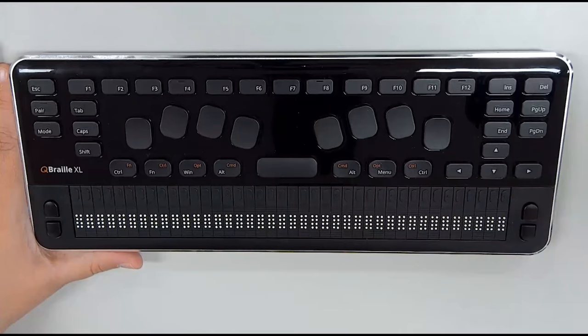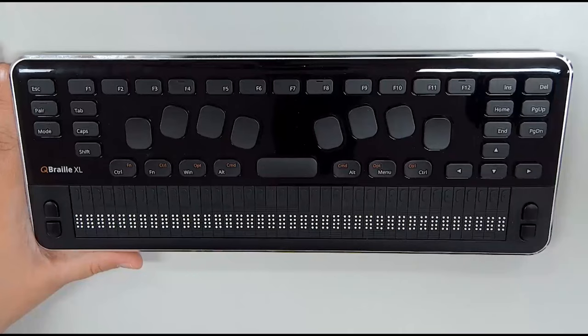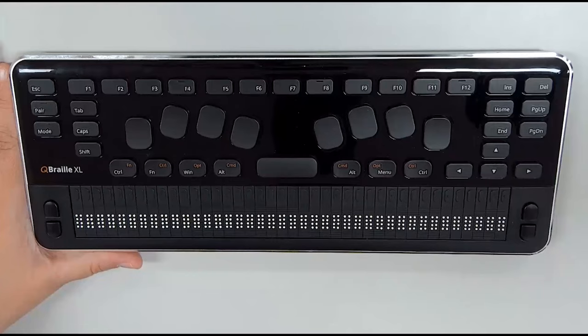And above that, we have a six-pack that's sort of turned on its side. So across the top, we have Delete and Insert. Then underneath that, we have Home and End on the left and Page Up and Page Down on the right. If we go to the left of the Perkins-style keyboard, we have Shift, Caps Lock, and Tab in their usual positions.